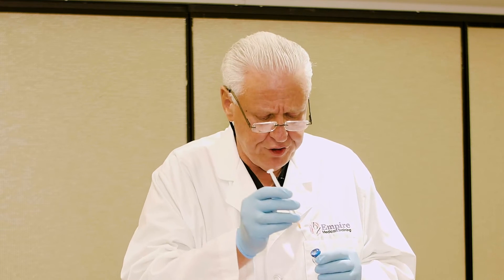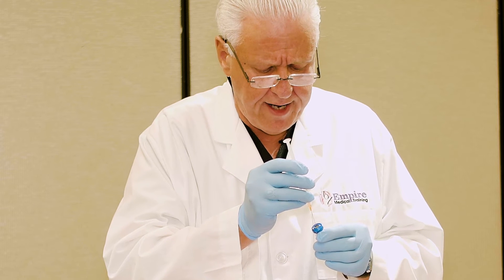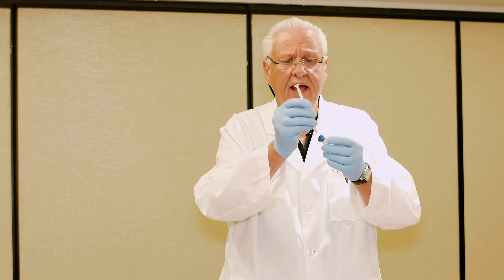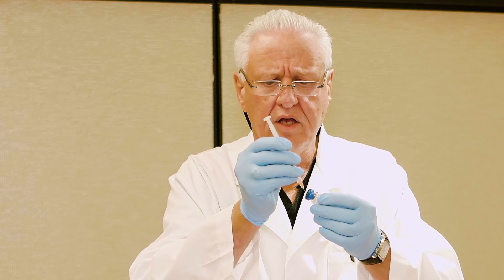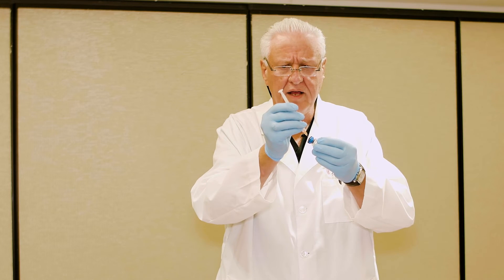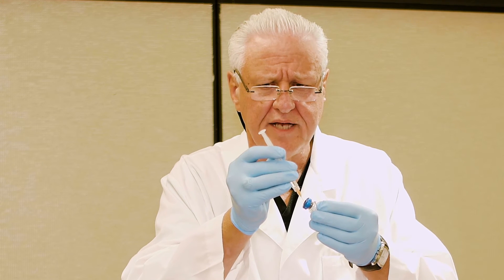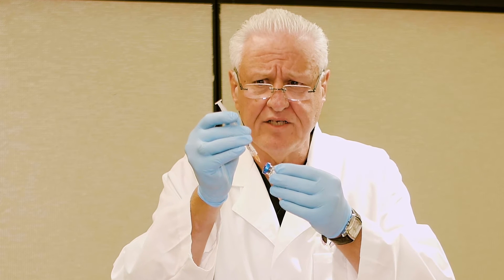With that pressure, you want to place the needle through the stopper at an angle that's going to put the product down the side, and by slowly releasing the pressure on the plunger you'll be able to monitor the volume and fluid going into the vial at a very slow rate. Remember, the caution here is not to denature the product — and you can see the plunger advancing as I release the pressure.